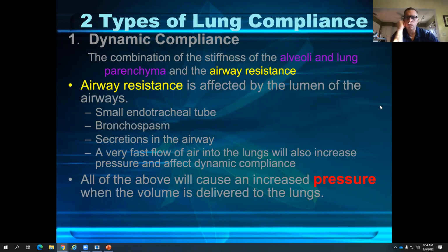I would say it was the size that lined up with the patient, what it should be for a male or female. You want to use the largest one possible. Yes, so the larger the tube that can fit comfortably through the vocal cords is the size tube that you want to use.